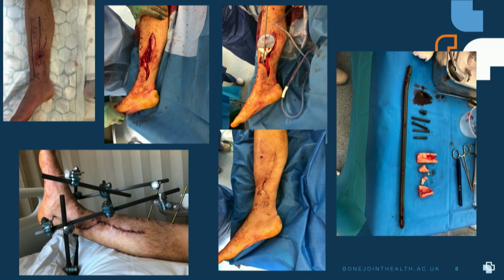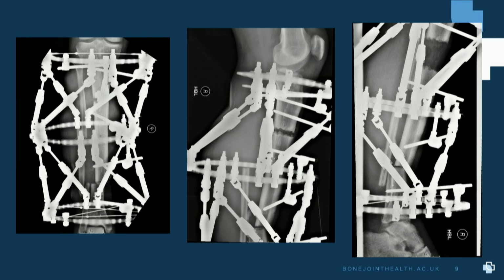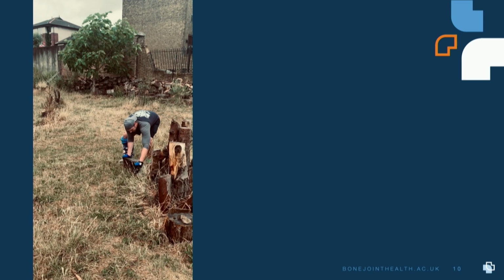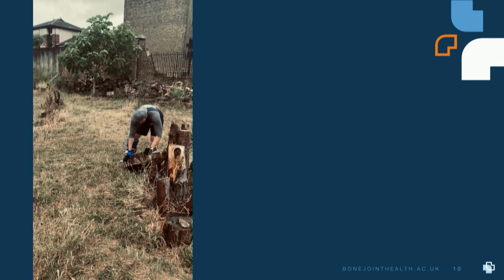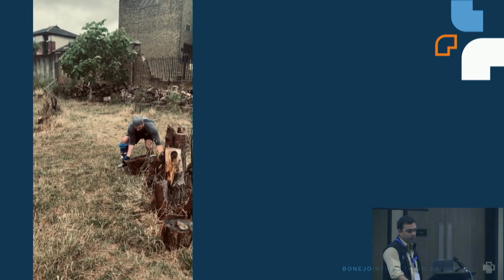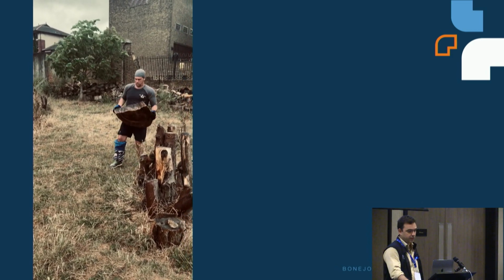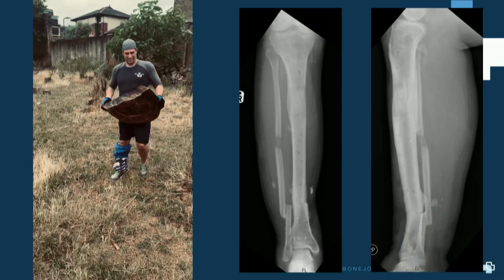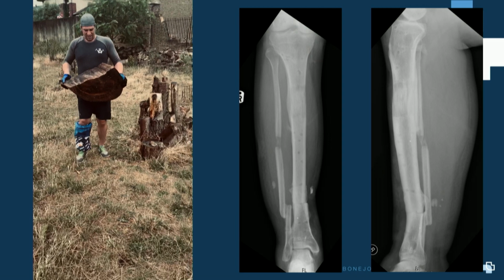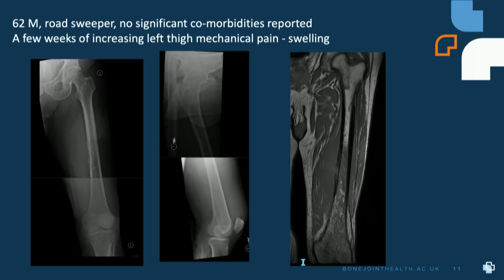And in more complex cases, again, we have treatment protocols where we do a good debridement and maybe more complex treatments like bone transport, which are very compatible with everyday living. This guy has a frame on while on bone transport, an extreme example, but it can happen, and we get good alignment. But sometimes decision-making is not that straightforward.